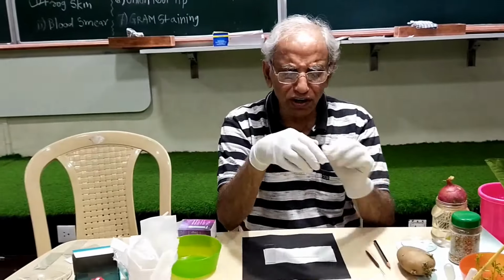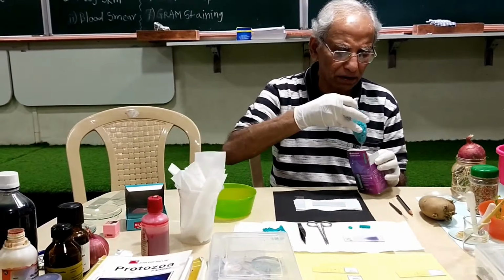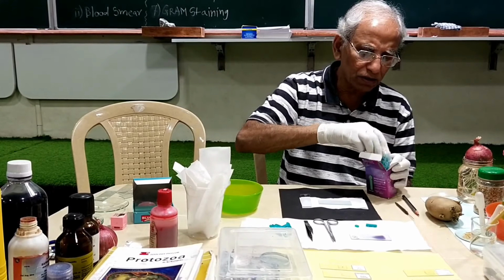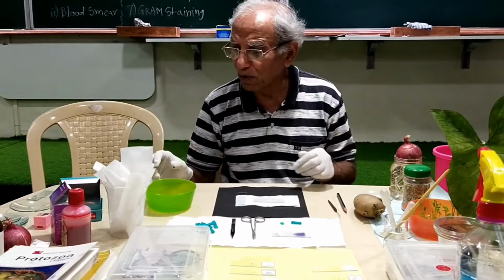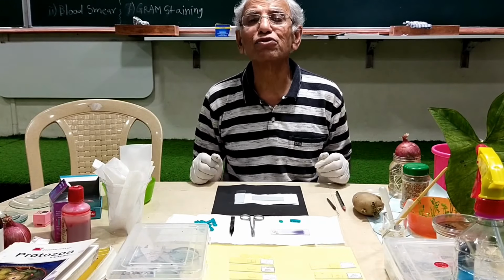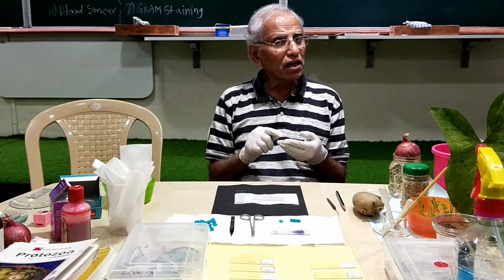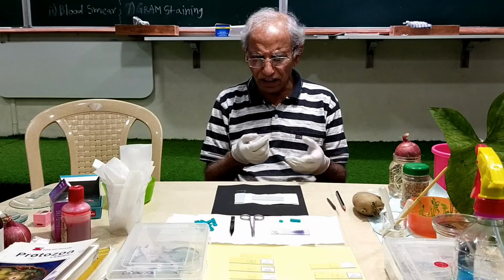Well, it's already sterilized, so there is no problem, and I'm putting back the others just to make the stage clear for demo. Now, sterilization is very important, because you have to sterilize the finger and then just take a drop of blood. That's quite easy.